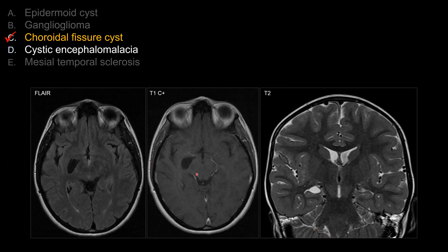Choice D is cystic encephalomalacia. The cystic dilatation may be due to prior infarction. However, it would be very strange for old infarction to show no signs of gliosis at all, so cystic encephalomalacia does not make a lot of sense here. Also, if you look at the coronal view, you will appreciate the typical location for choroidal fissure cysts. Rather than seeing volume loss, there is mass effect — so this is not due to old infarction.